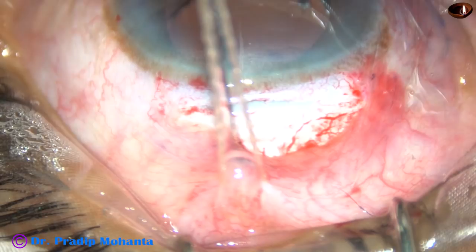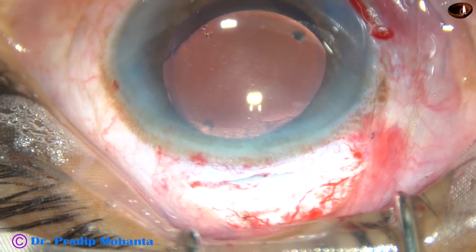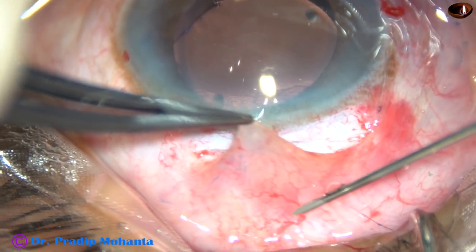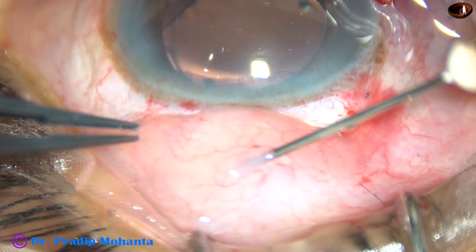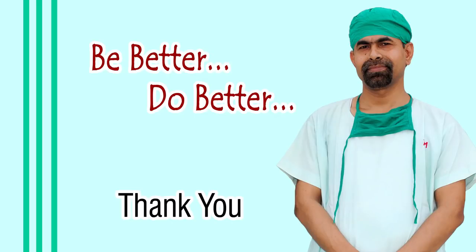This is how the anterior chamber is formed. Then the superior rectus bridal suture is removed. Subconjunctival dexamethasone and gentamicin is being injected — it will push the conjunctiva forward, and when the lids are closed the conjunctiva will go near the limbus. Thank you very much for watching. Hope this video will give you essential tips for SICS.